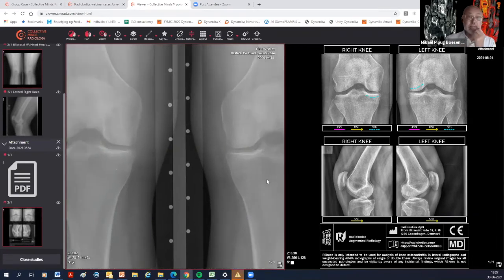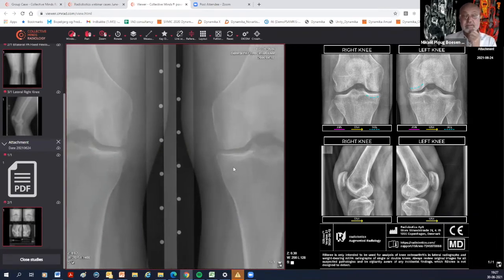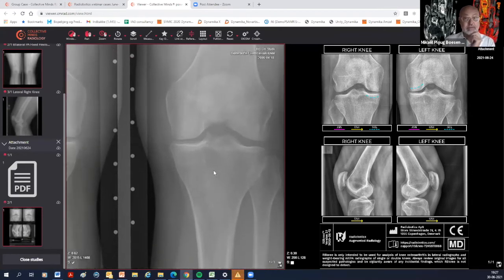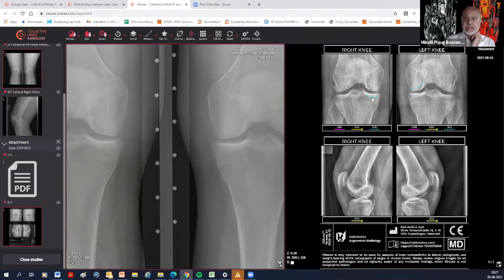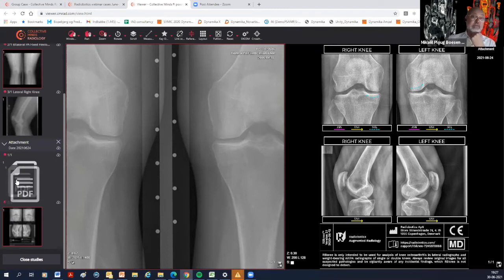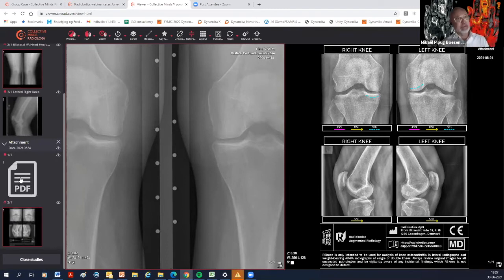The next case shows widening of the end plate — especially visible in certain areas — without clear osteophytes. The Radiobotics tool depicts this: we don't have osteoarthritis yet, but we have some sclerosis. This can confuse inexperienced readers into thinking it's a mild case of OA, but it really isn't.